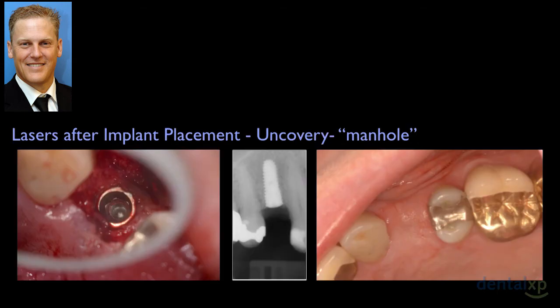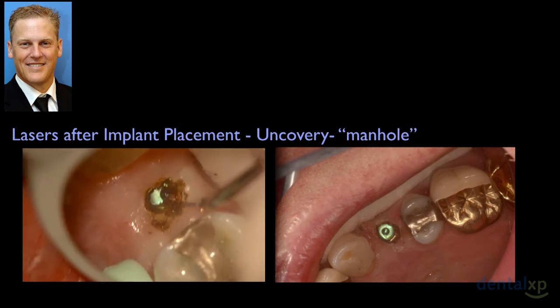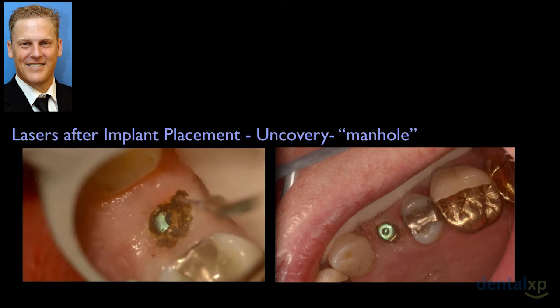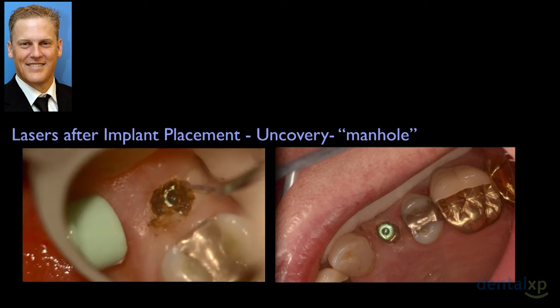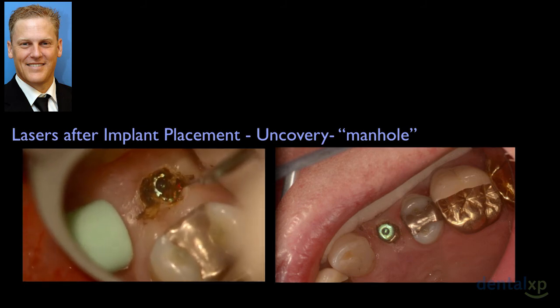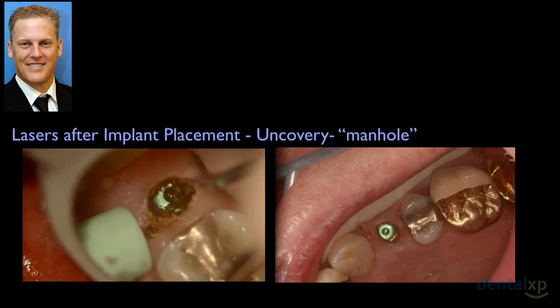Here's a particular case where I had to bury an implant. Patient came back, and at the 3 months interval, we're exposing the soft tissue in the posterior area using a diode laser at about 1 watt or less. Romanos has shown in his studies that 15 to 20 seconds of continuous energy, particularly at higher settings, can cause a greater than 10 degrees Celsius rise in threshold temperatures. So I would tell you to periodically put a little bit of water on to cool the site.